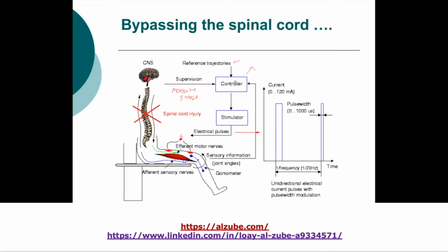And if there is a match, there are ways for us to look at these matches for patterns in large data sets using something called the cross correlation. So if we can do cross correlation between a measured signal and the database, if we have a match, then you say, okay, go stimulate the right leg in order for it to lift the lower foot.